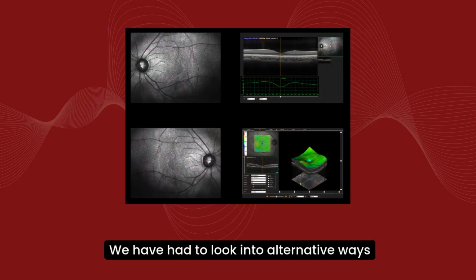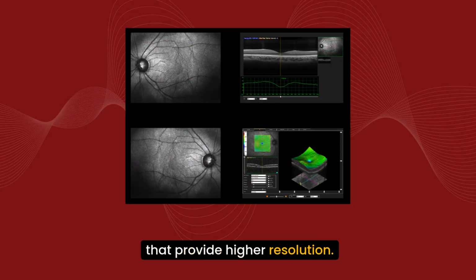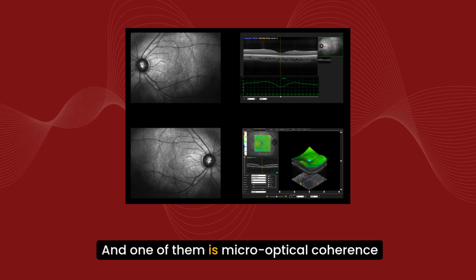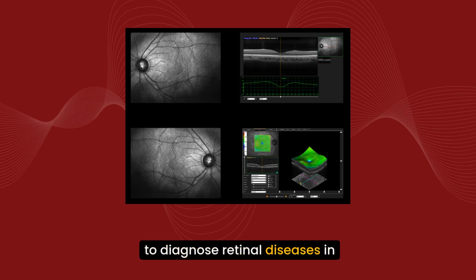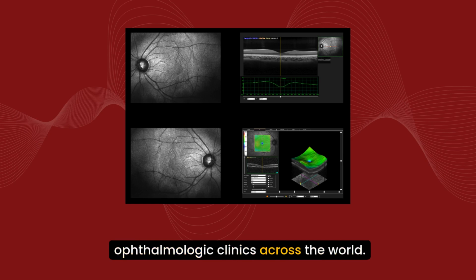We have had to look into alternative ways that provide higher resolution, and one of them is micro-optical coherence tomography, which is a high-resolution successor of optical coherence tomography, which is a technique that's routinely used to diagnose retinal diseases in ophthalmology clinics across the world.